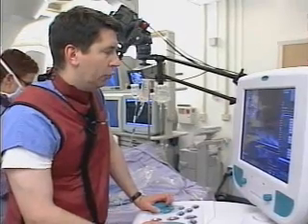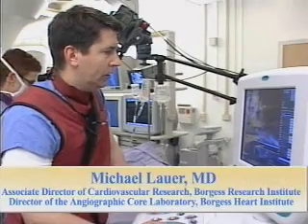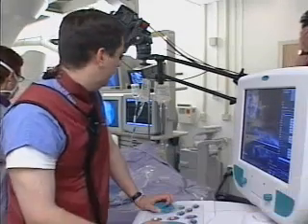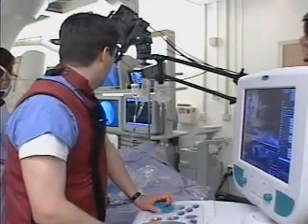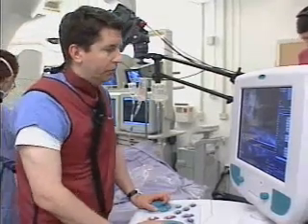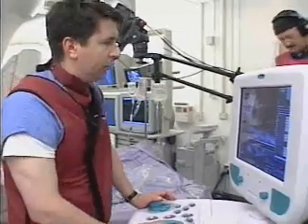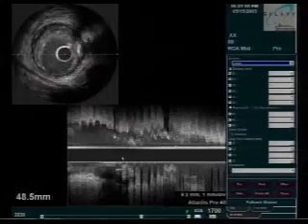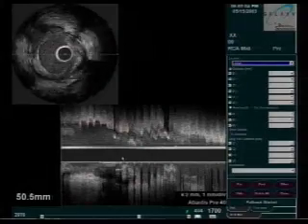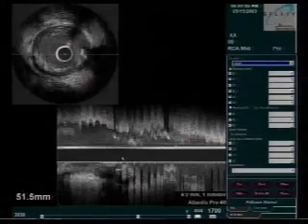We're now proximal to the lesion. We're going to go ahead and continue the pullback for a while so we get a nice, good section of healthy vessel proximal to it. We'll go ahead and complete it all the way back to the ostium of the artery. We see there's a little bit of buildup of plaque here, proximally, not quite as severe as we saw more distally. And that was the reason when we first put the catheter in, there was a little bit of spasm in that area.